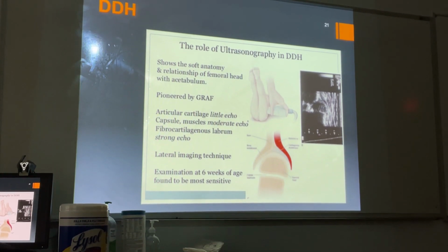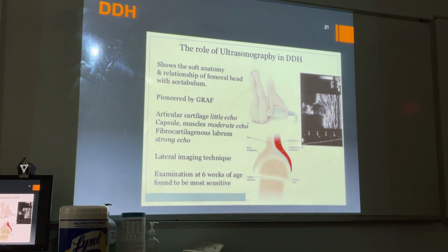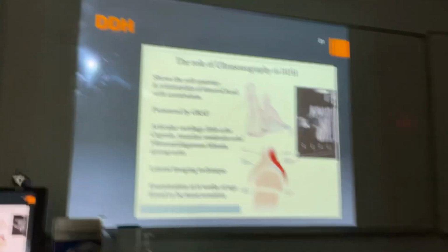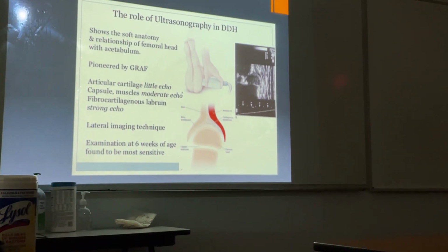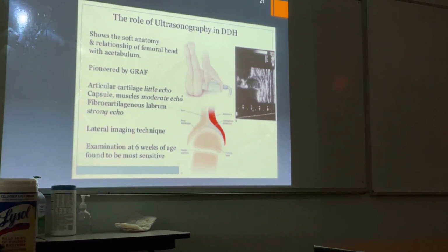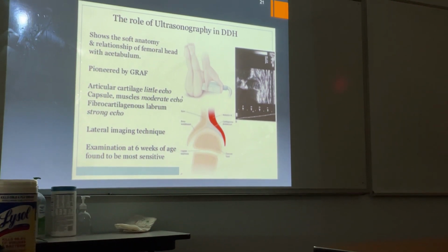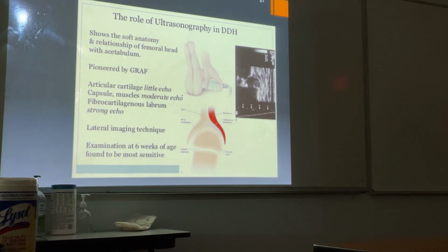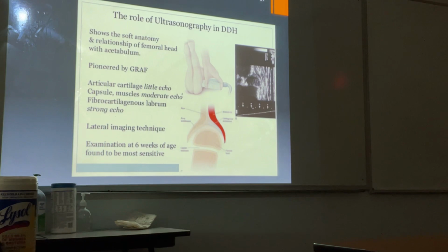So you can add one more thing to diagnostic ultrasound. Gallstones, nephrolithiasis, uterine fibroids in the female. And now, if you're worried about the little person and you thought there might be effects, if you didn't see anything on your plain film, you can ask for diagnostic ultrasound to evaluate the possibility of delayed developmental dysplasia of the hip. It's a nice exam, not that expensive, just a question of whether there's availability wherever you are.